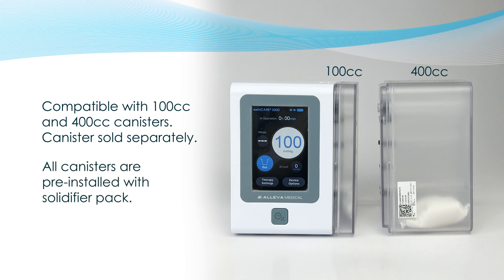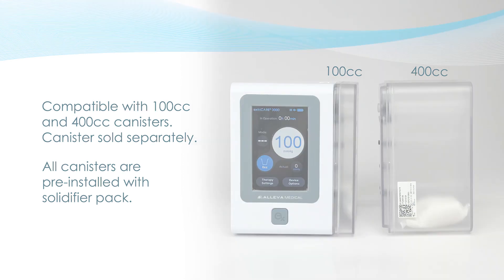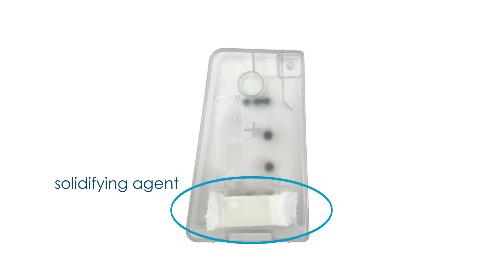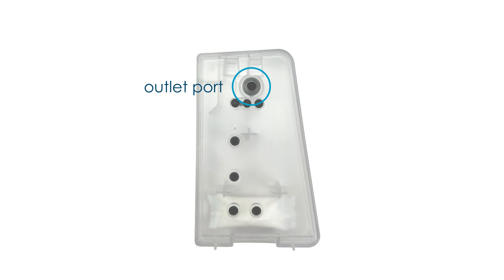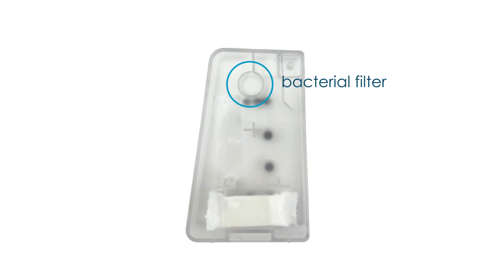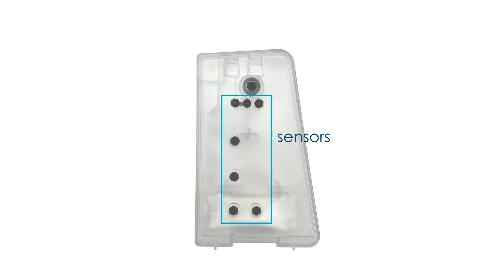Canister Features. Each ExtraCare 3000 unit is supplied with a 100 cubic centimeter canister. However, there is also a 400 cc sized canister that is sold separately. All canisters have a white packet at the bottom — this is the solidifying agent, so any fluids that enter the canister will be gelled immediately. The canister has an inlet port on the side which connects to the dressing. On the outlet side facing the pump, you will notice a charcoal filter which helps remove any odor from the exudate. There is also a white bacterial filter that minimizes contamination to the pump, and sensors that identify the fluid level inside the canister and whether the canister is properly installed.